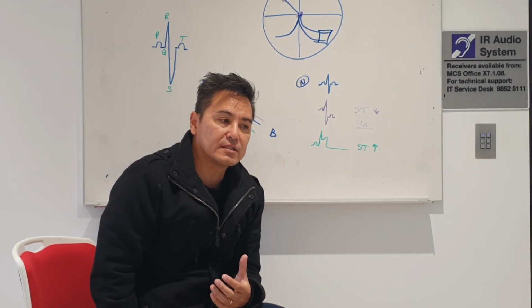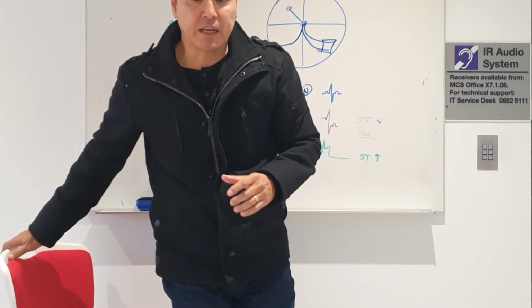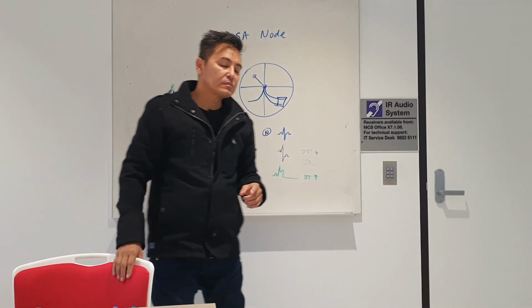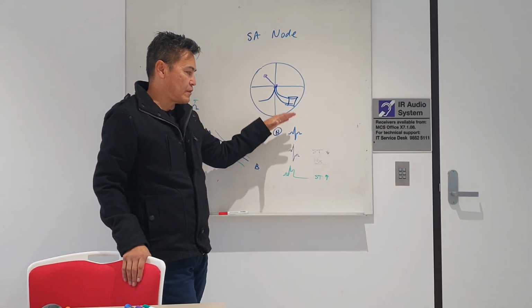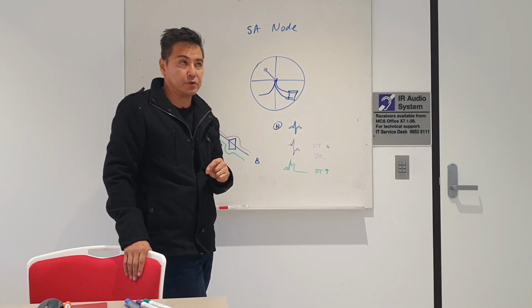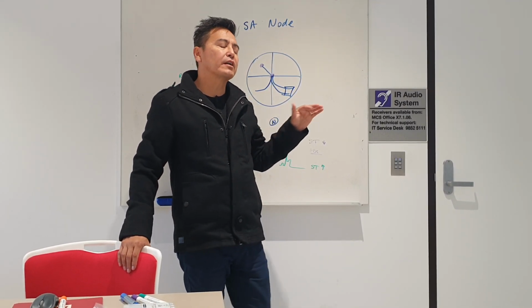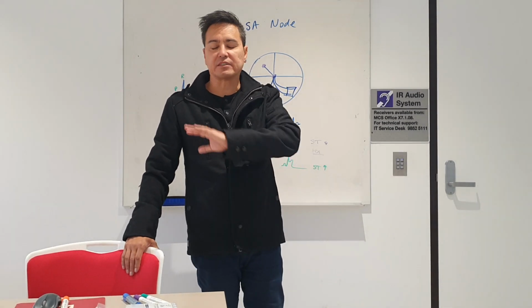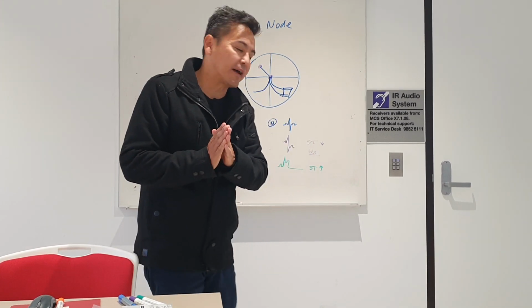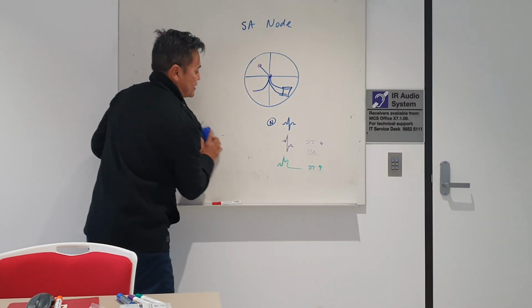So when you do a 12-lead ECG and somebody comes in with pain, we can determine whether that pain is old heart pain or whether it's new heart pain, okay? So I just wanted to go over 12-lead ECGs with you on what's happening from an electrical point of view, right? And I want to push you a little bit further. So by now, if you kind of think, okay, well, he's being a bit too basic or whatever, then turn the video off. But if you want to now go into 12-lead ECGs, I want to talk to you about that, all right? So I'm going to rub this out, because you already know this probably.